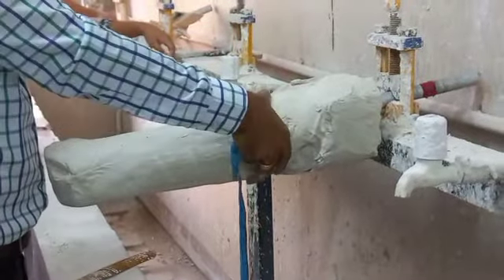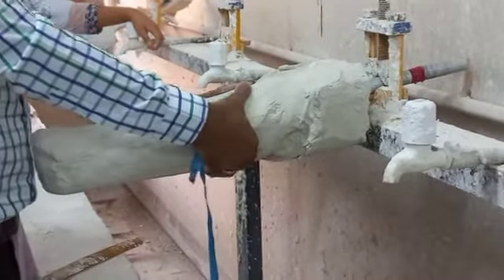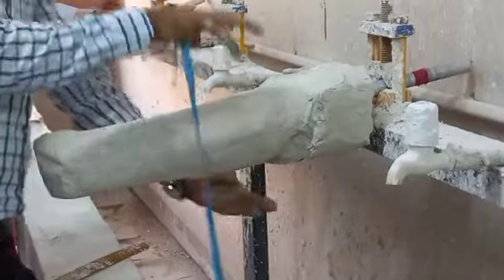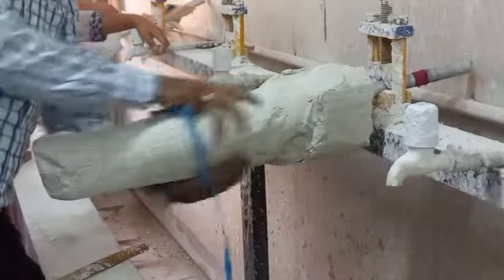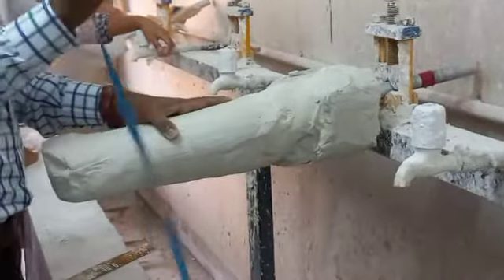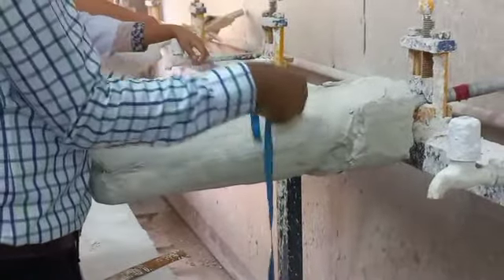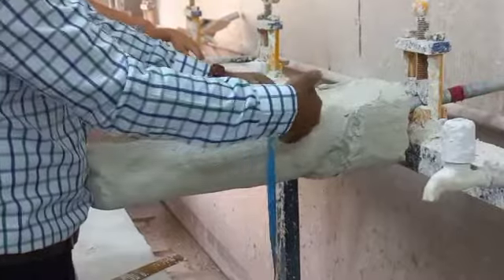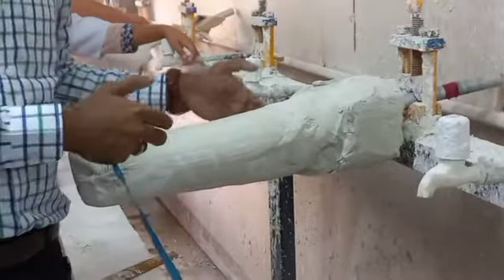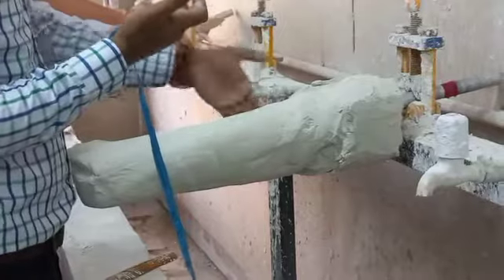So my motto is not to disturb the shape, and therefore I am telling you to reduce globally. Okay, reduce all over, because whatever shape you have taken over the patient stump, we have loaded it mediolaterally because we want compression in the mediolateral side mostly, and therefore if we reduce more on this side, the shape will change. But let's say when you are reducing from 55 to 50, you reduce just below the GP and all over this area. Sometimes you have to reduce a little more material, then you reduce from the area where there is more soft tissue, mostly the back side. So from this area we reduce a little more.